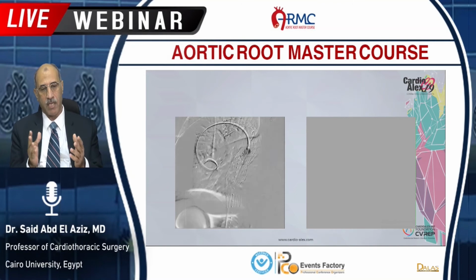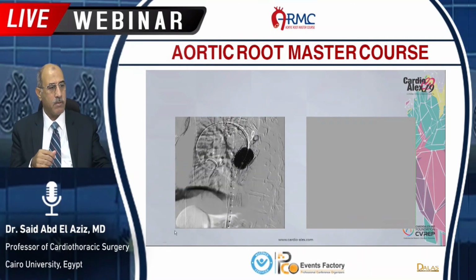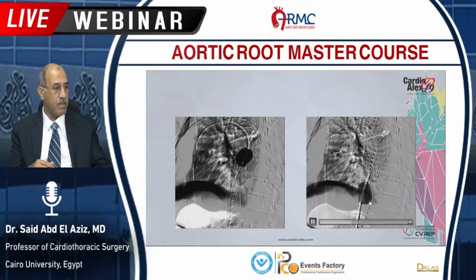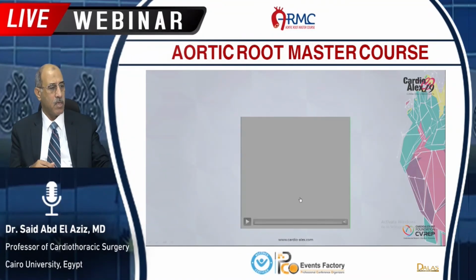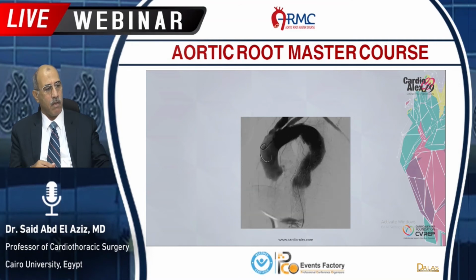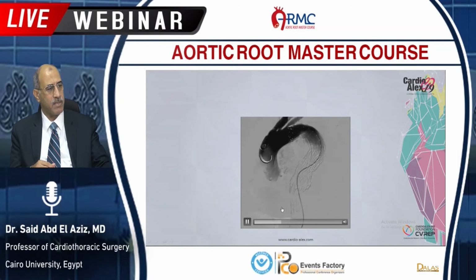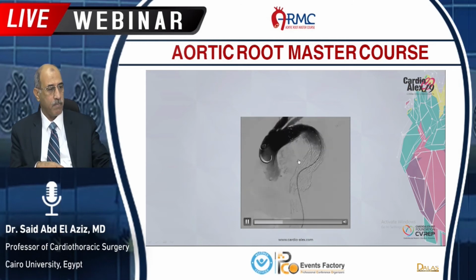This type of endoleak is a type 3 endoleak between the 2 stents, and we will balloon the distal end also. And after that, we got the final result, a good deployment and alignment of the 2 stents and complete disappearance of the aneurysm that we saw before.